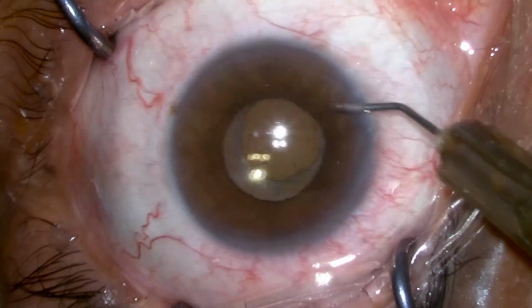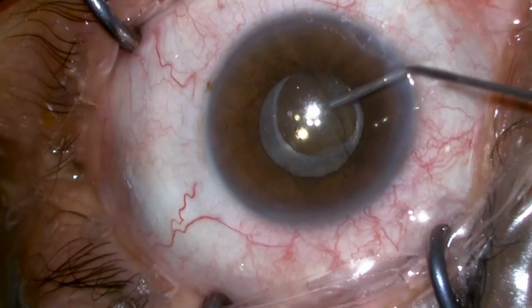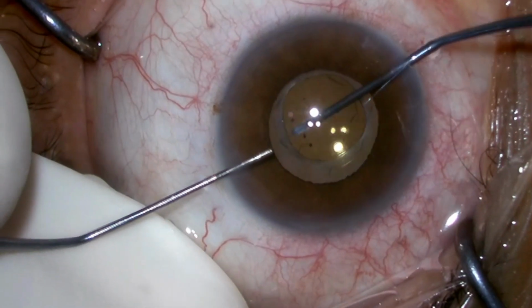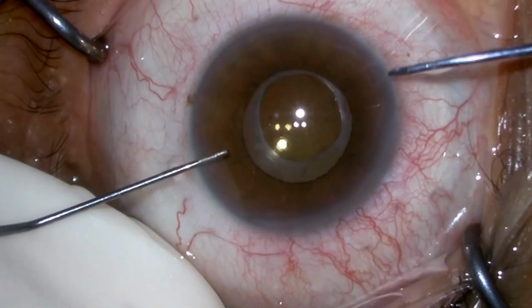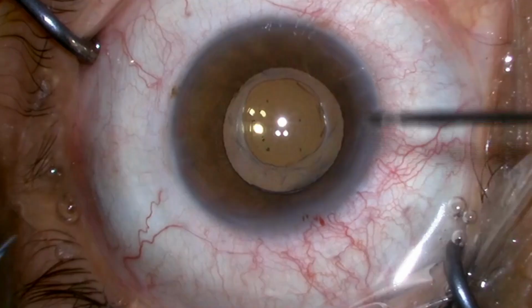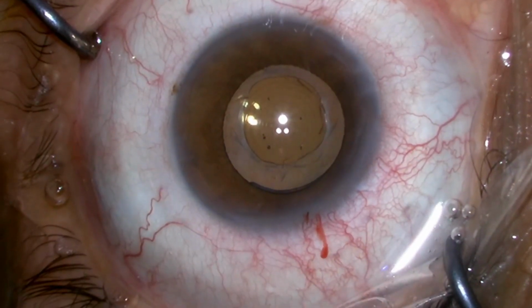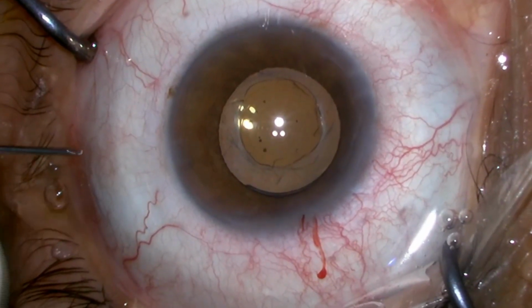It dilated a little bit. Another challenge in this case, apart from the patient having a capsulotomy, is that this is a 2 year old case and the anterior capsulotomy is also very small. So first we are trying to enlarge or disengage the lens from the anterior capsular margin. And now we are trying to enlarge the capsulotomy so that it will be easy to take the lens out of the bag.